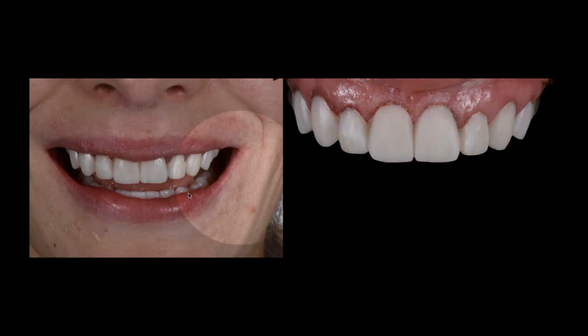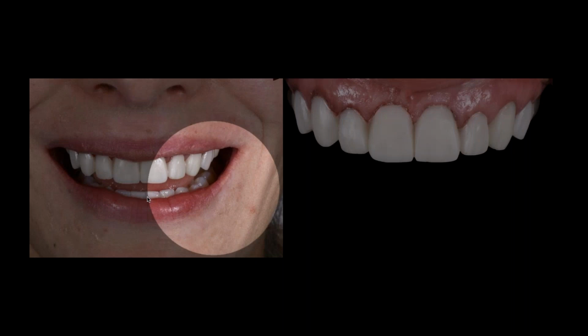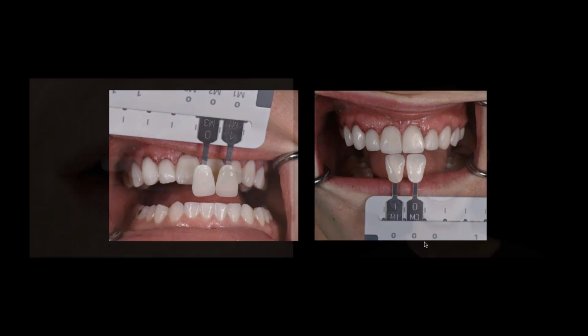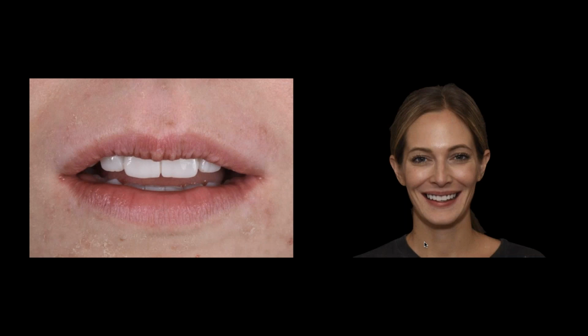And we can see that the alignment of the teeth look pretty good. It's pretty much what we wanted. So we're feeling confident about that. We're checking all the shades again to make sure the direction that we want to go. And then I'm going to come back and actually finish up the restorations.